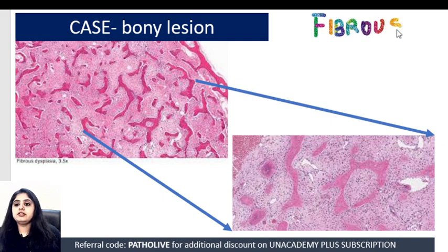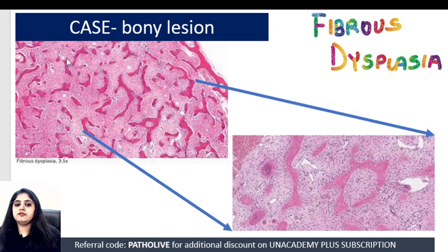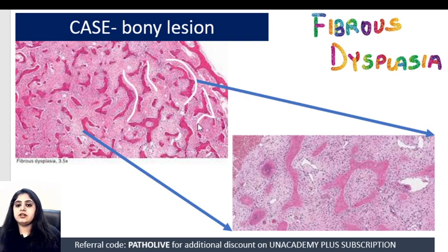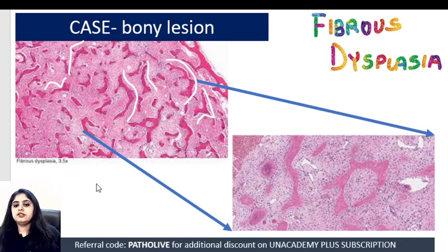How did I identify this as fibrous dysplasia? The first and most characteristic finding is that the bony trabeculae are all weirdly shaped — they look like Chinese letters. They are curved, taking alphabetical shapes. I call them Chinese letter pattern: they look like a C, or an S, or some random Chinese alphabet. First and foremost, I see a Chinese letter appearance.